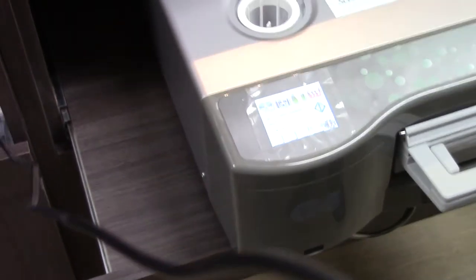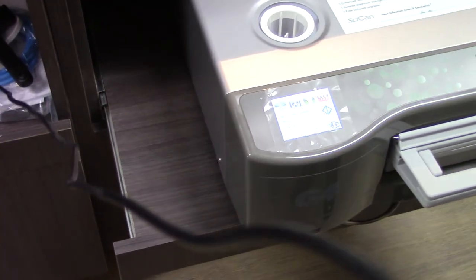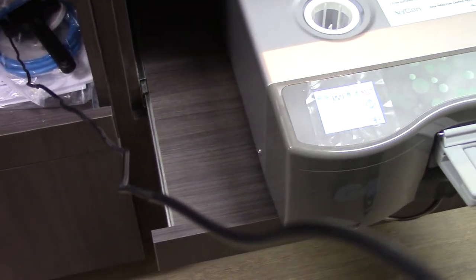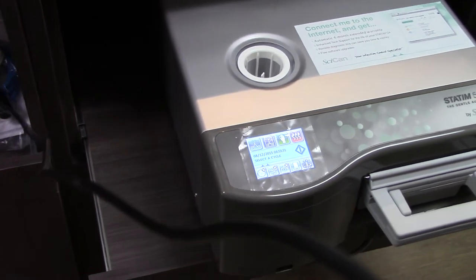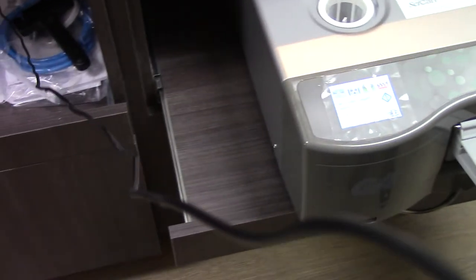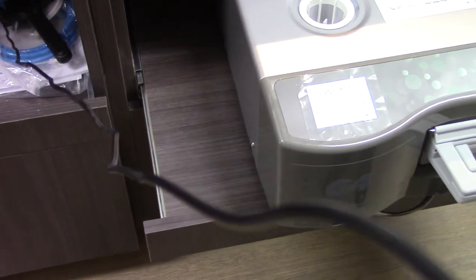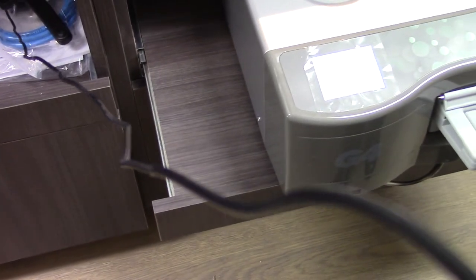Okay. So if we're in a pinch, we need that handpiece in 9 minutes, can you just use it straight away, or do you have to let it cool? It'll be a little hot. Yeah, it'll be a little warm. You might want to let it cool down first. Okay. And you don't recommend running it under water, right? Probably not. Just the extreme hot to cold. It'll warp it. Yeah. But I would say honestly, after a minute, it'll be cooled down enough where you can use it.